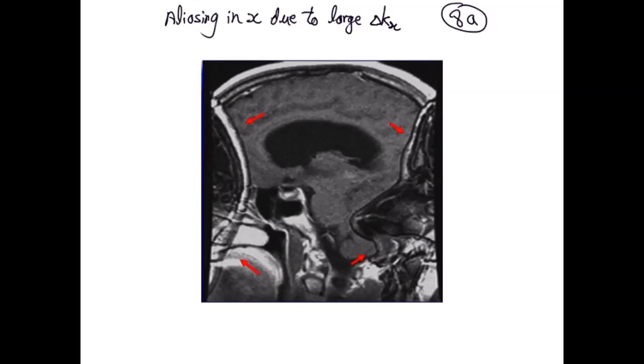It really depends what type of data you need. For example, if you have some study where it is important to have a certain level of noise that is consistent across subjects, or certain things that you want to keep consistent, then sometimes they'll keep them, right? But ideally you want to adjust to every patient.